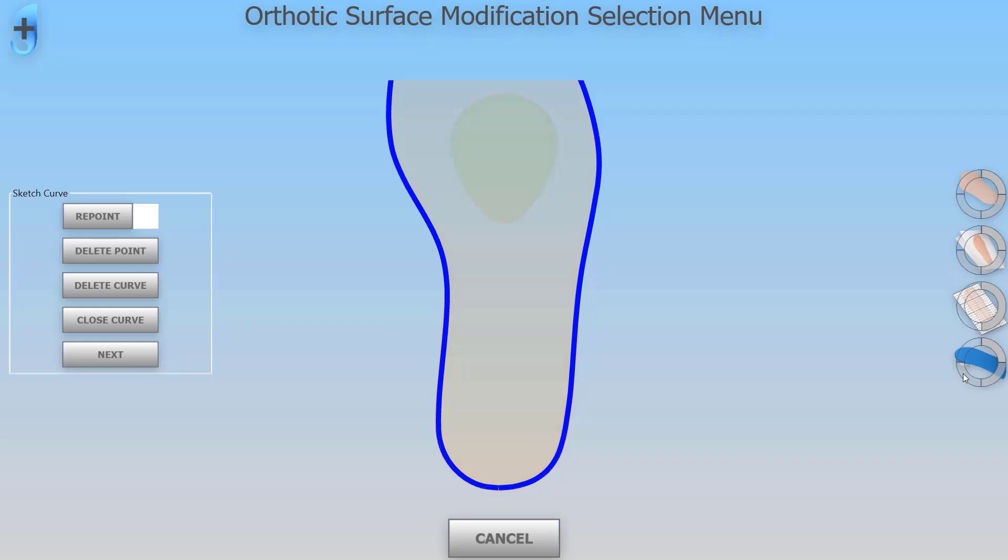To improve the accuracy of our design when we're in the surface modifications tool, we can now visualize existing shapes while we're designing new ones. This increases the accuracy.